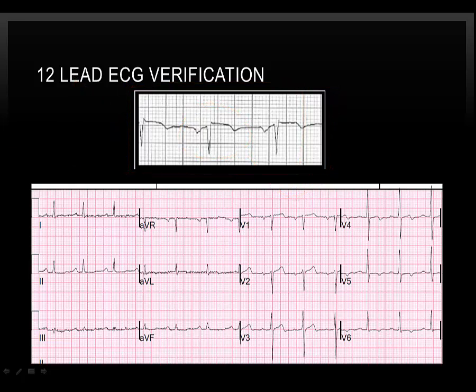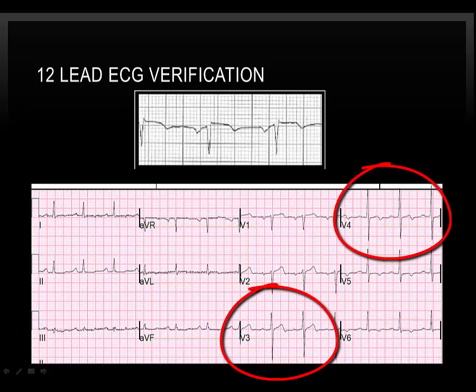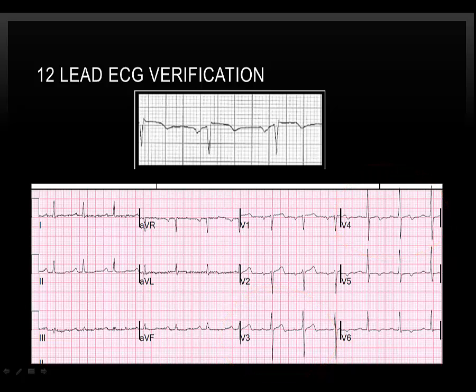In the precordial leads, or V leads, we look for R wave progression to confirm proper lead placement. Notice how the size of the R wave increases until between leads V3 and V4, the QRS goes from one that is negative to one that is positive. Poor R wave progression can occur when the wires are misplaced on the wrong side, like V2 on V4, for example. If you see poor R wave progression, look to see if the wires are in the right location. If they are, then this could indicate pathology.